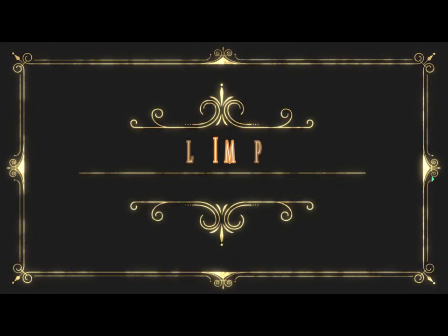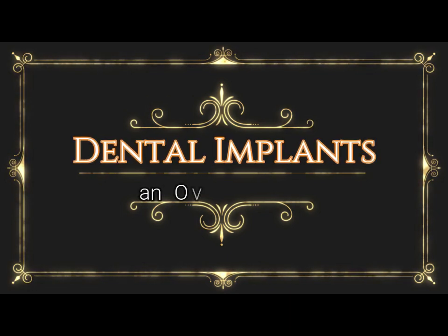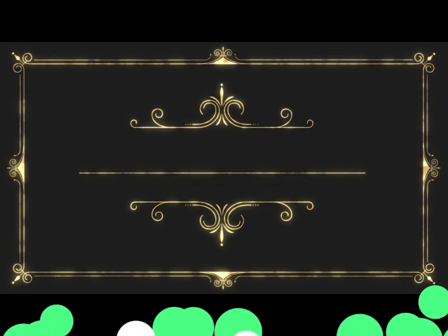Dental implants, an overview. Dental implants, also known as oral or osseous implants, have been used to replace missing teeth for more than half a century. They are considered to be an important contribution to dentistry as they have revolutionized the way by which missing teeth are replaced with a high success rate.